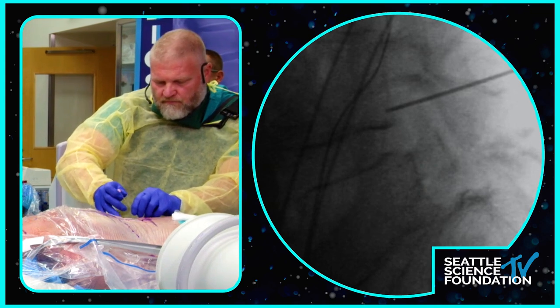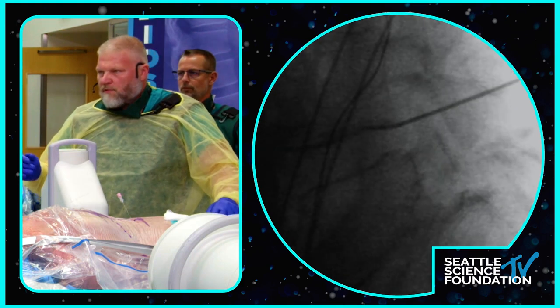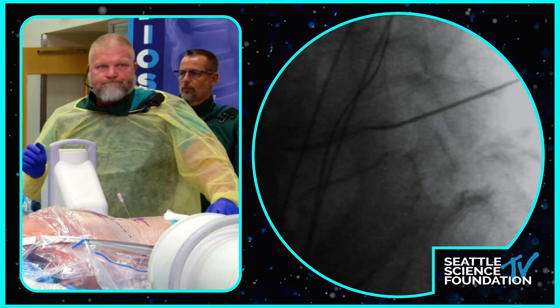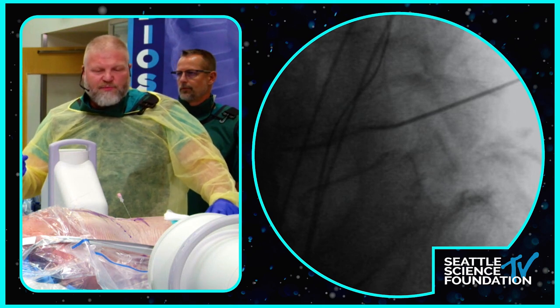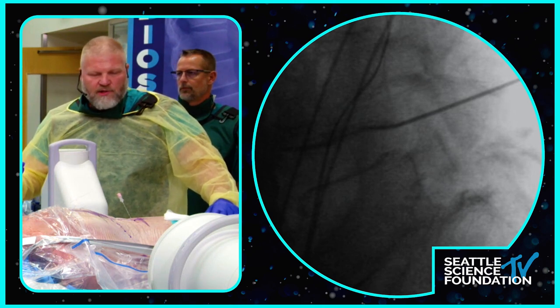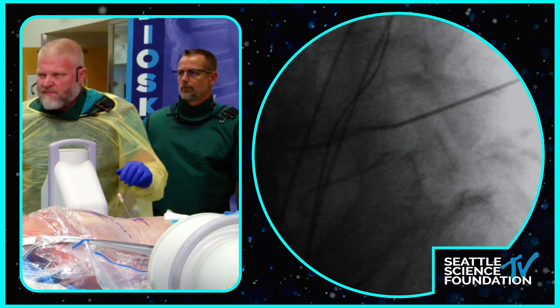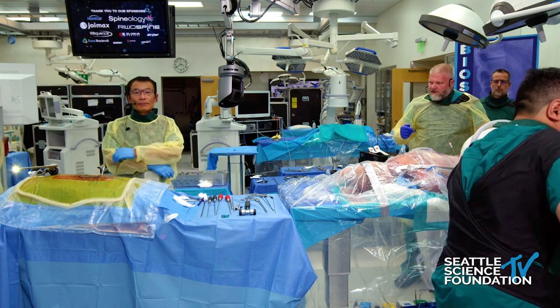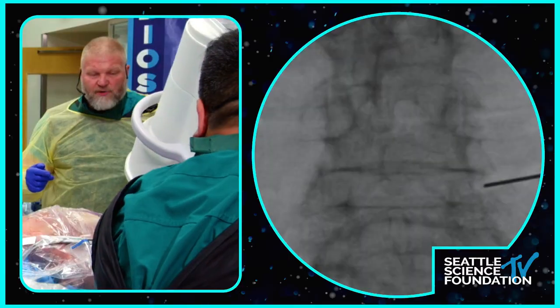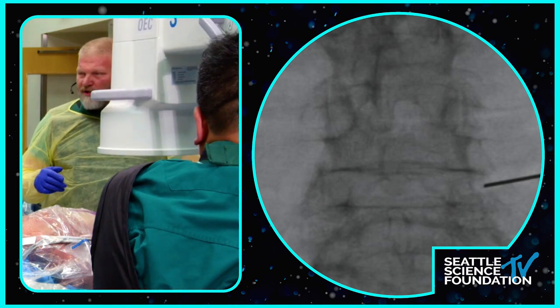Ray, do you ever use the bullseye view, just going straight oblique, so you can sneak ventral to the SAP? No, I always use AP and lateral. This is the same way I do my transforaminal epidural injections and the same way I do my transforaminal discectomies. So back to AP. Now I should be on the disc space. And basically what I want to be is over the top of the pedicle, about the medial pedicular line.